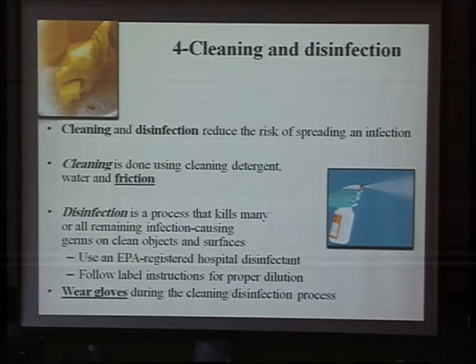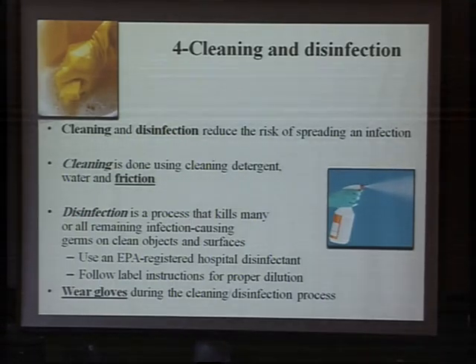So they should use friction. This is the difference between cleaning and disinfection. And of course, we should wear gloves. For the housekeeping, they should have heavy utility gloves, not the ordinary glove, for cleaning or when a blood spot is present in the environment.